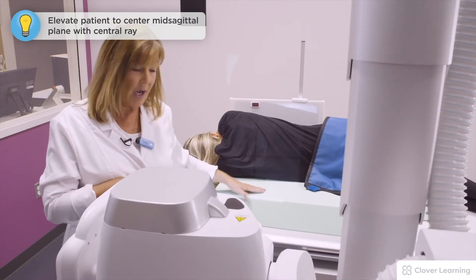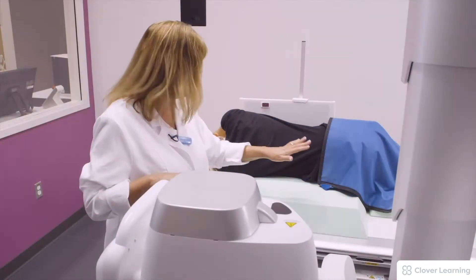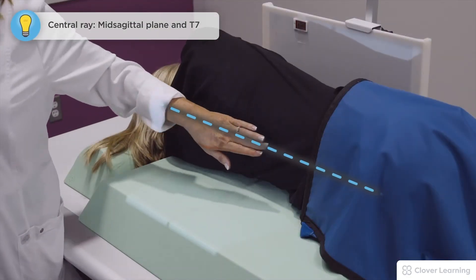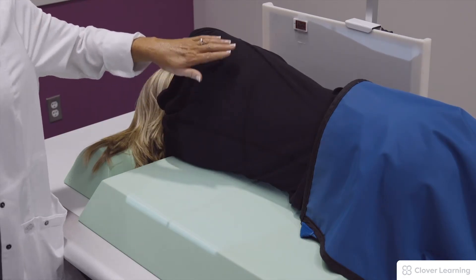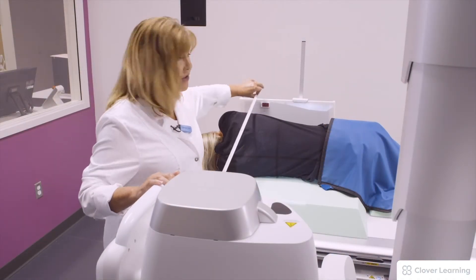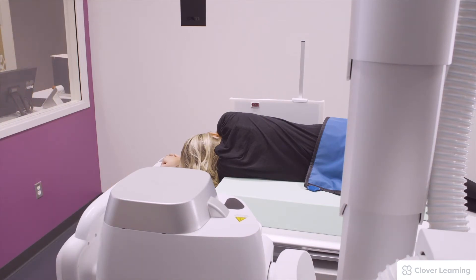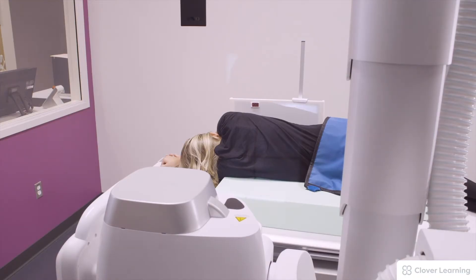We have built our patient up with a large sponge so that she is higher than the level of the IR. My patient is on their left side. The x-ray tube is now in decubitus, which is horizontal to the floor. Our central ray is at the mid sagittal plane and T7, which is the inferior angle of the scapula. I have a right marker indicating the right lung field. We want to make sure that you have a 72-inch SID. The patient is going to take in a big deep breath, hold very still, blow out, take in another big deep breath, and the exposure is made.